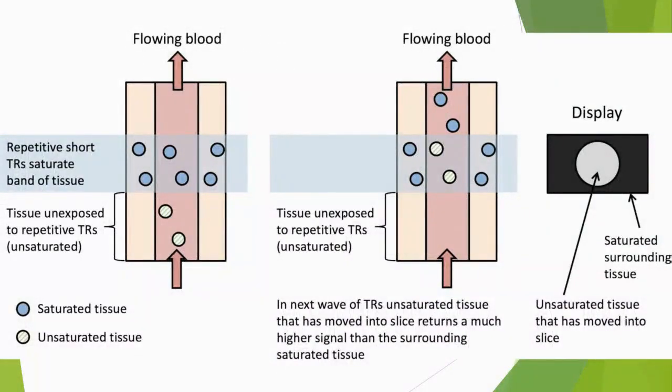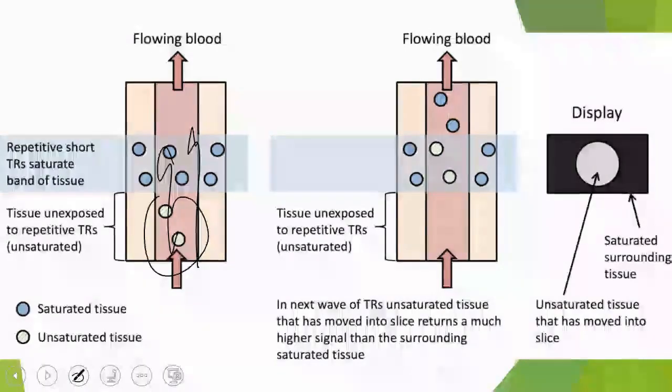For example, if we are talking about an area like cerebral angiography, where the blood flow is slow, your technique relies on the blood flow moving quickly, right? If this movement is slow, that could affect you, and the process won't run smoothly. There must be another technique, especially since you might need to work on something else, like the aorta. That's why even in cerebral angiography, there are techniques with contrast enhancement, and there is something called phase contrast.